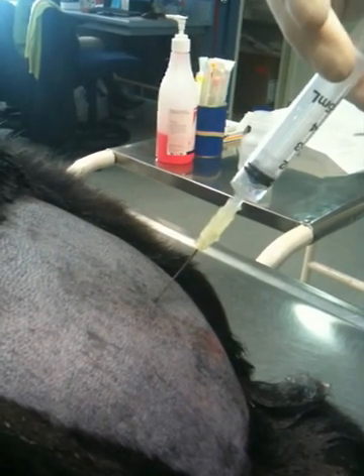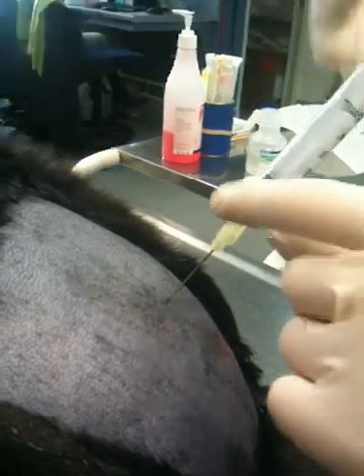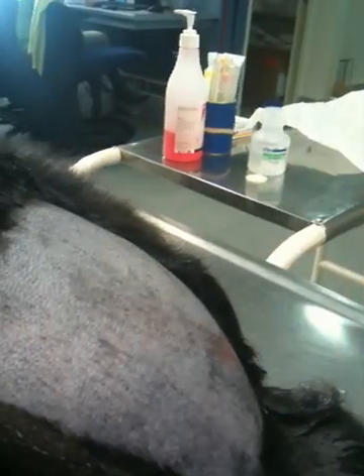Right, and smoothly going in. Coming out. Beep.